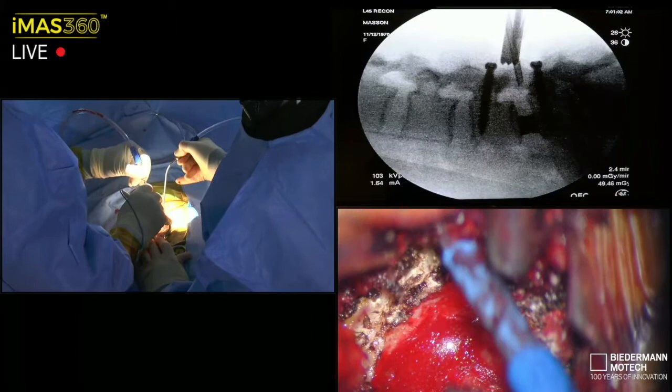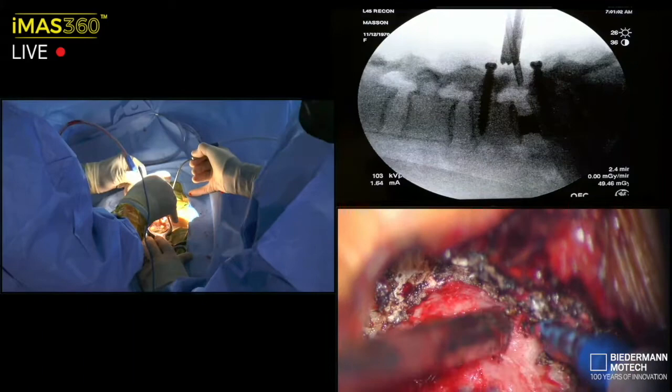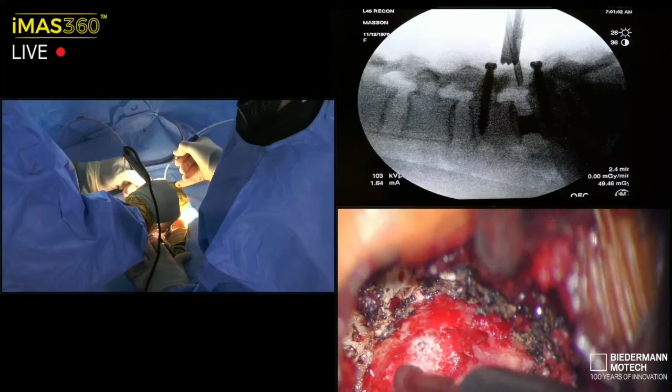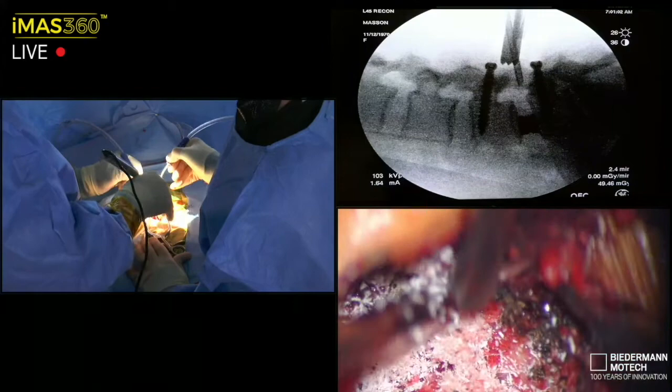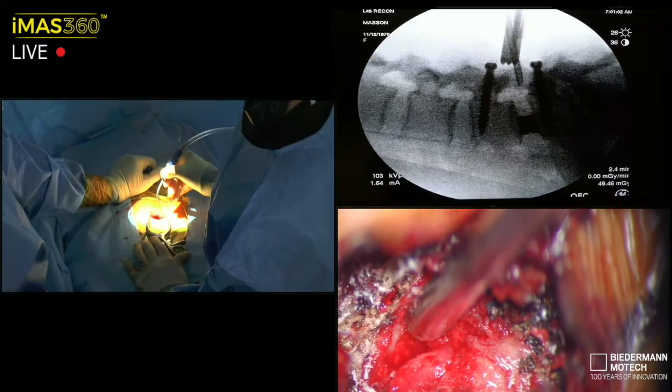So I've got a nice superior laminar interface coming up to this dorsal spinous process. So it gives me the roof of the previous exposure. And here's the floor down here. So let's go drill. I like to invest early. This preparation, the slowdown that I'm doing right now, really safely accelerates things once I'm ready.